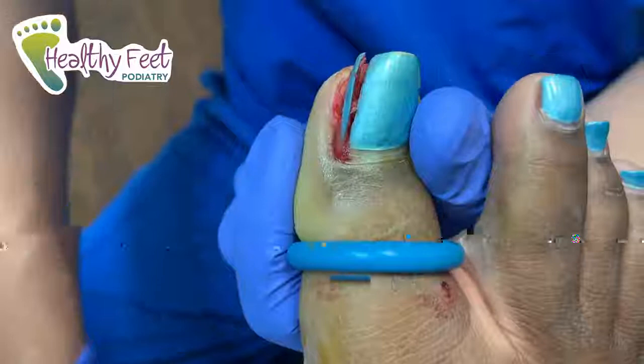All right, so this is a little bit of sodium hydroxide. We're burning the root here. There's different ways of applying the medication. Some apply it 3 times, some apply a little bit longer. I do it 2 times and a little bit shorter because I find that it still works and does just as well without causing any harmful side effects or complications. She's gonna heal up fine. Look, toe's still sexy. I'm bringing sexy back. Yep. You can't just cut nothing out. Really. Exactly, right?